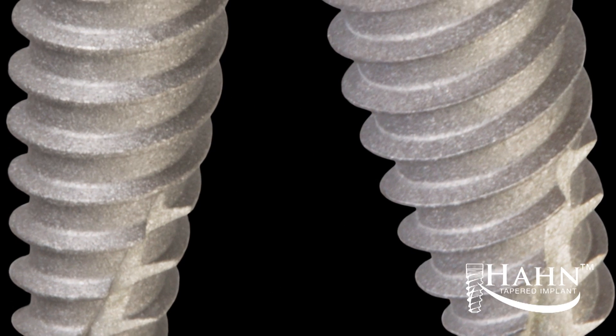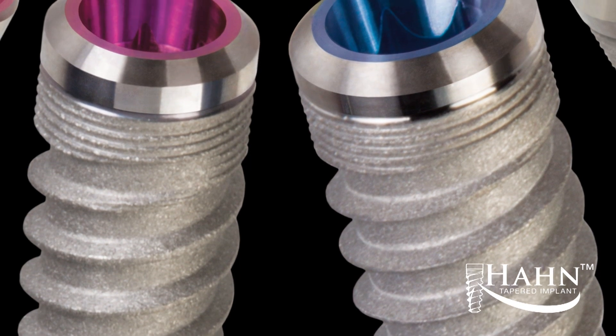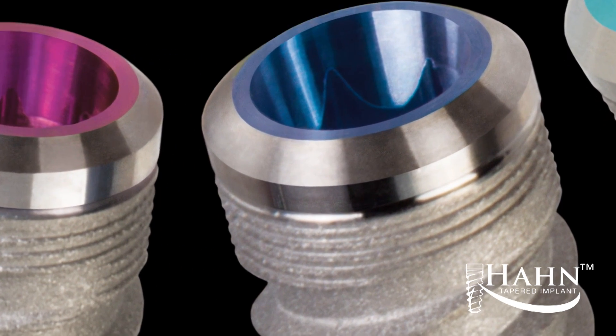The dual lead thread pattern and self-tapping grooves of the implant allow for swift insertion, and the coronal microthreads aid in the preservation of crestal bone.